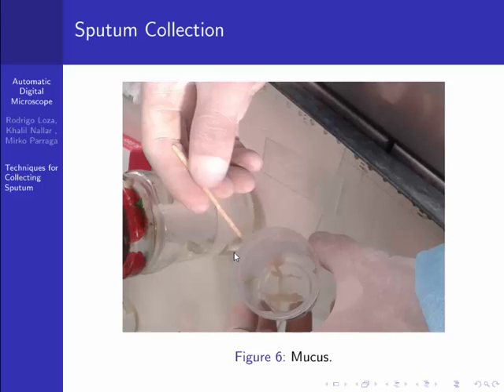Despite the facts that I have mentioned, mucus is also a good sample. For example, this week, we found a sample that had only mucus. Of course, the quality of the sample was not good because it was not sputum. Nevertheless, we could detect bacilli using this mucus, but that affects another variable as well, which is called the parasitic burden. A patient who we know has 3 crosses, and we get a mucus sample, we may identify it as 1 cross or 2 crosses.